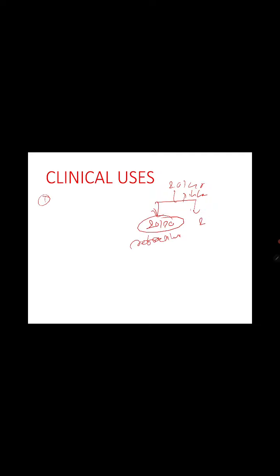If vision doesn't improve or even worsens, then we think it may be the cause of retinal diseases, or maybe cataract, or other things, or maybe amblyopia. So these are the things we should understand. This is the very first clinical use, and every clinic uses pinhole because of this reason. The first, primary and huge use in ophthalmology.